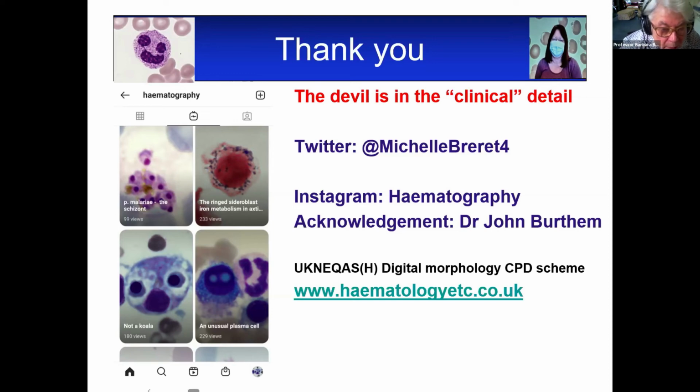I wonder, might I be permitted to make a very quick comment on Michelle's case? Yes, please do. Thank you for those very attractive pictures. There was an interesting thing also to note, and that was that several of your photos showed what I call a microdiscocyte, which is about the same diameter as the microspherocyte, but it's got central pallor.